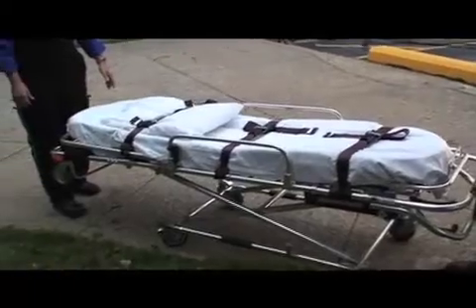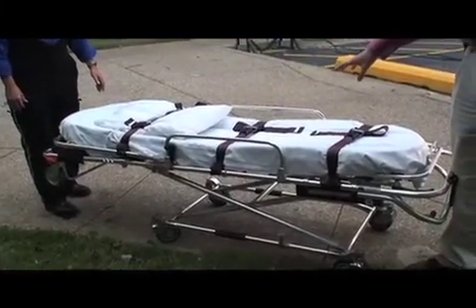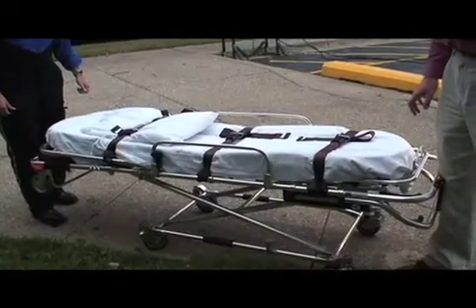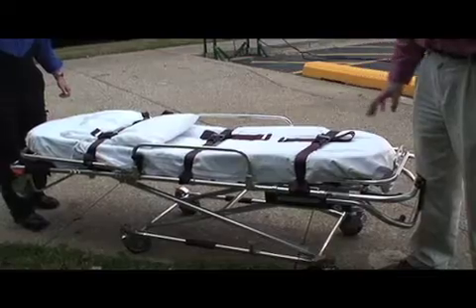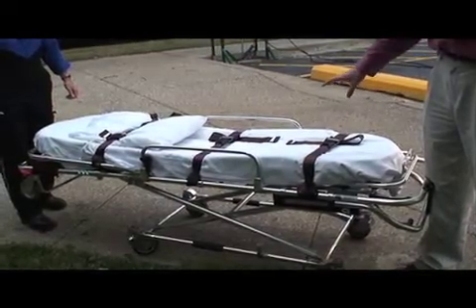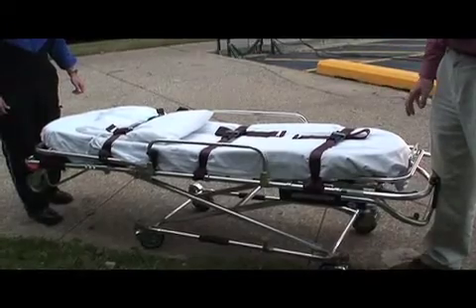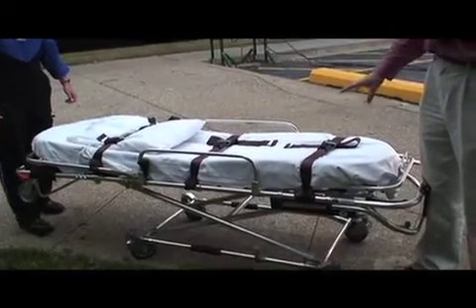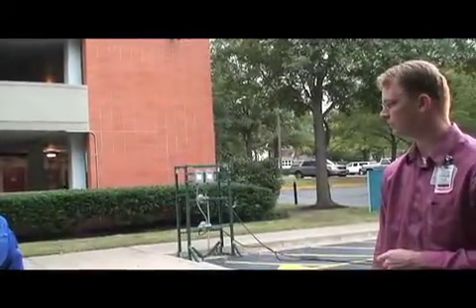Okay? All of our Bonheur stretchers, with the exception of the power lift, are rated for 500 pounds. So anybody over 500 pounds should not be placed on one of these stretchers. The power lift stretcher is rated for 700 pounds, and that's an isolette only. So we don't have any stretchers greater than 500 pounds. And if we have a patient that meets those criteria, then we'll ask another service with bariatric capabilities to do that.